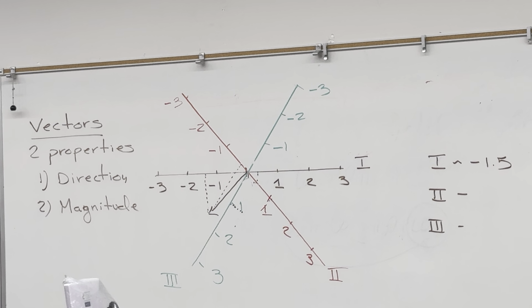All right, now, you're going to do lead 1. You're going to record lead 1. Here's what you're going to do. The red electrode is going to go here. That's your positive electrode. The black electrode is your negative electrode. That's going to go here. And the ground is going to go here. That's lead 1. Everybody wrote that down, right?